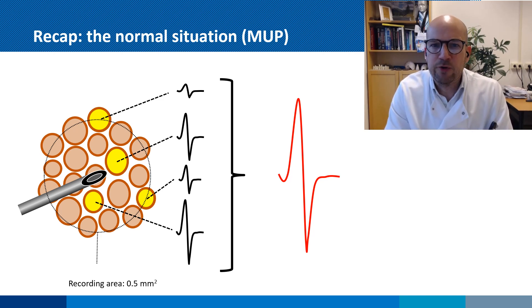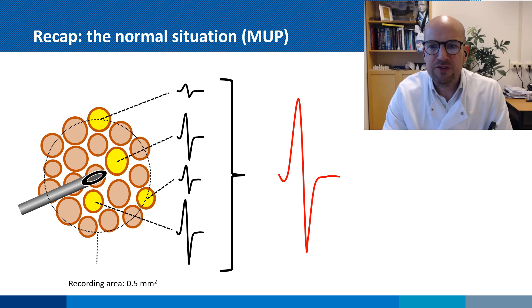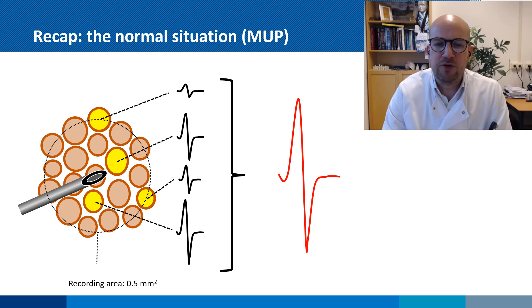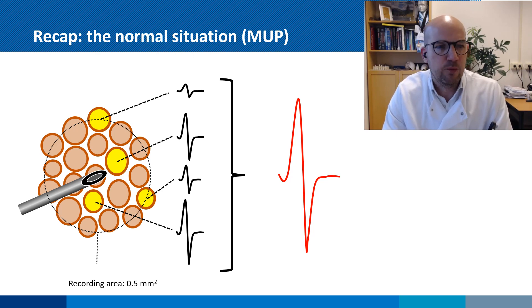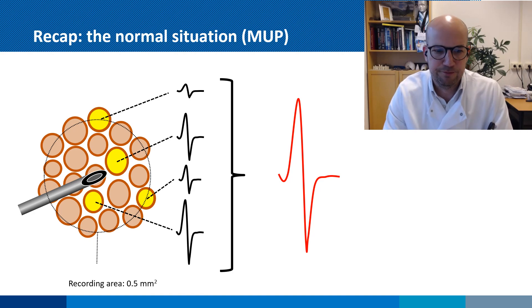I will now show you what a normal EMG looks like. Have a look at the morphology of the motor unit potential, see if you can recognize and distinguish different motor unit potentials. Also try to evaluate the recruitment pattern at the end of the video, when the patient is asked to apply a bit more force and the screen fills with a large number of MUPs.